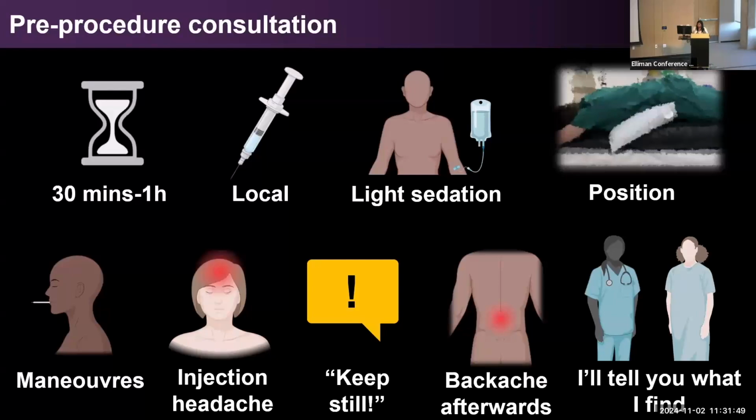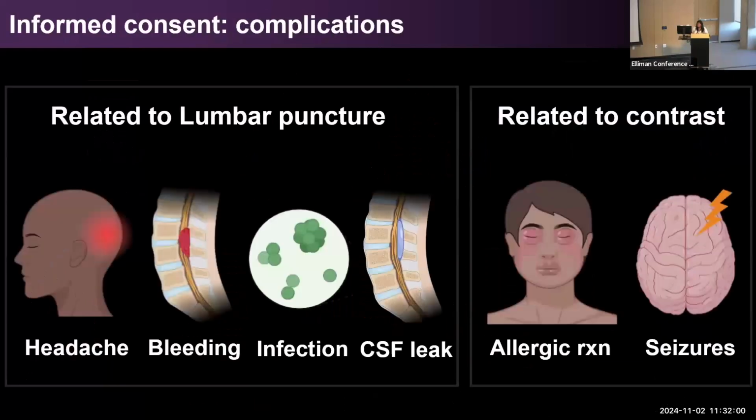And then usually what patients most want to know is, when am I going to hear from you as to what you find? And most of the time I'll say, look, if I find a leak on the table, I'm going to tell you straight there and then, but I'm also going to come and see you afterwards and talk about what that means or any treatment.